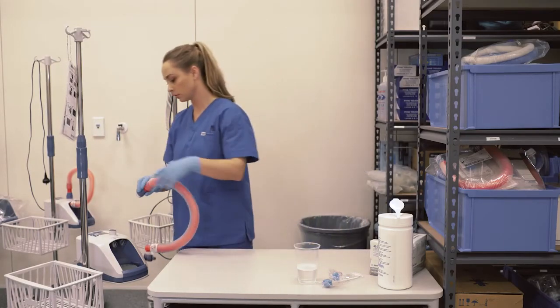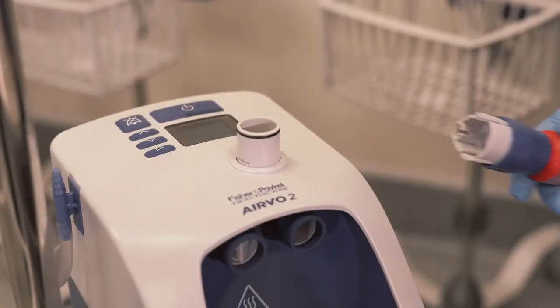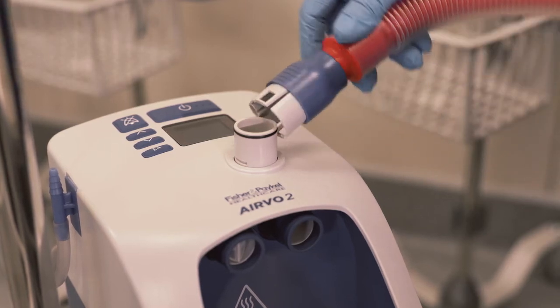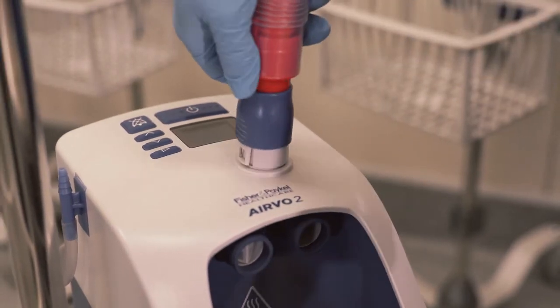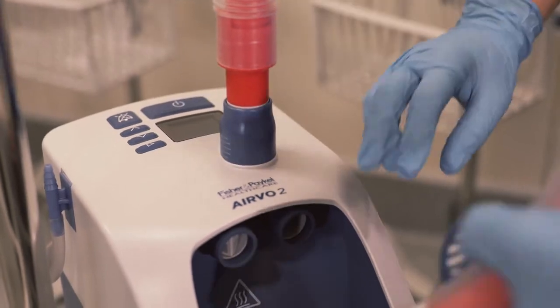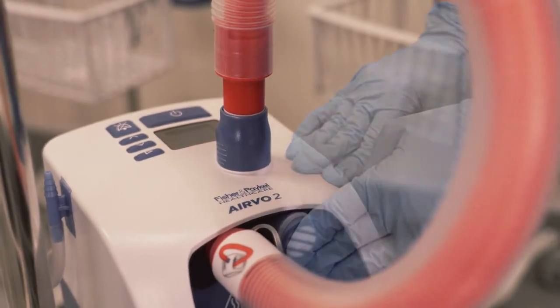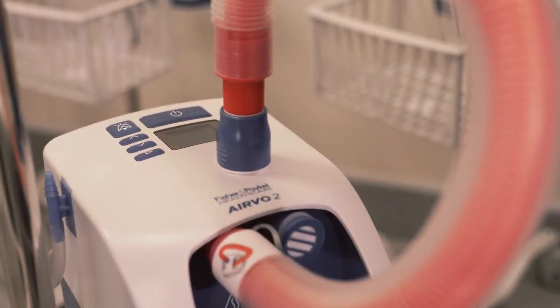First, connect the red disinfection tube to the Evo2. One end of the disinfection tube has a blue plastic connector — lift the sleeve and slide the connector onto the unit, then push the sleeve down to lock. Connect the red end of the disinfection tube to the left-hand chamber port and push fully into position. Then fix the blue filter cap securely onto the right chamber port.